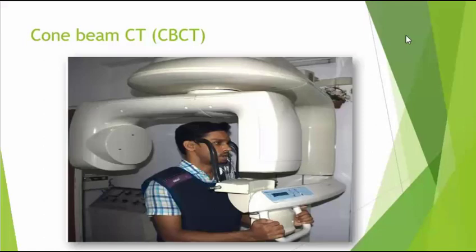Cone beam CT utilizes a cone-shaped X-ray beam directed toward the patient's head, whereas a fan-shaped X-ray beam is used by traditional medical CT scan. Multiple two-dimensional projection images are acquired for the field of view selected according to the region of interest in CBCT.